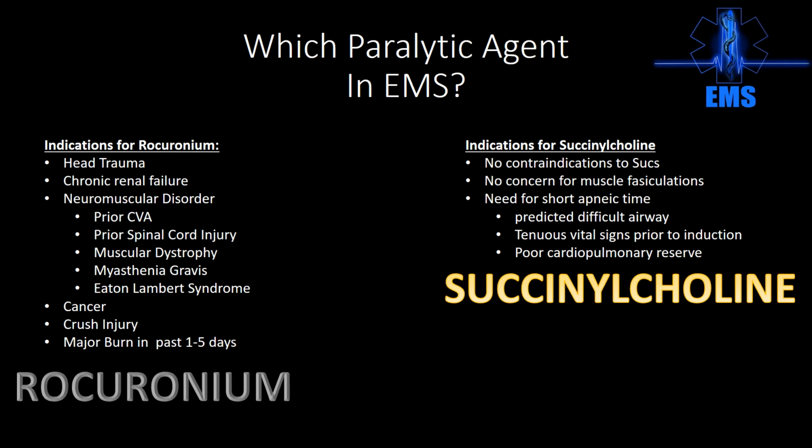Tenuous vital signs prior to induction, i.e. somebody who needs oxygen now, who is failing bag valve mask therapy, and I would largely question whether or not it's safe to intubate that patient in the EMS setting with poor lighting, poor positioning, and relative lack of resources. You're probably better off putting a BIAD in that patient and transporting them to a hospital who has an OR where the patient can get a surgeon and an anesthesiologist who can secure that airway much more safely.